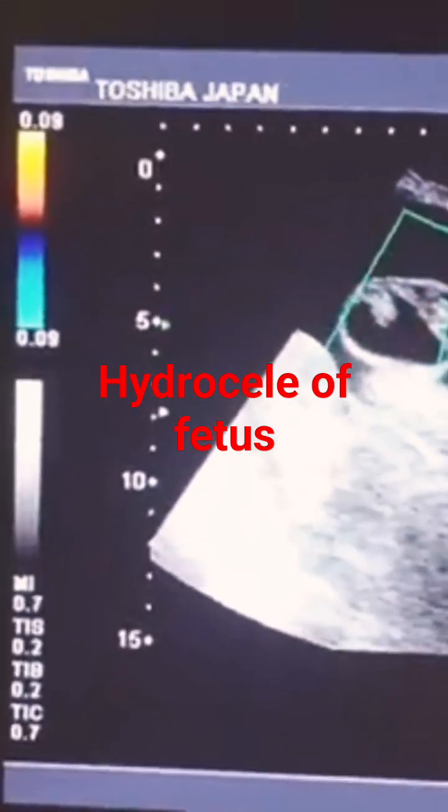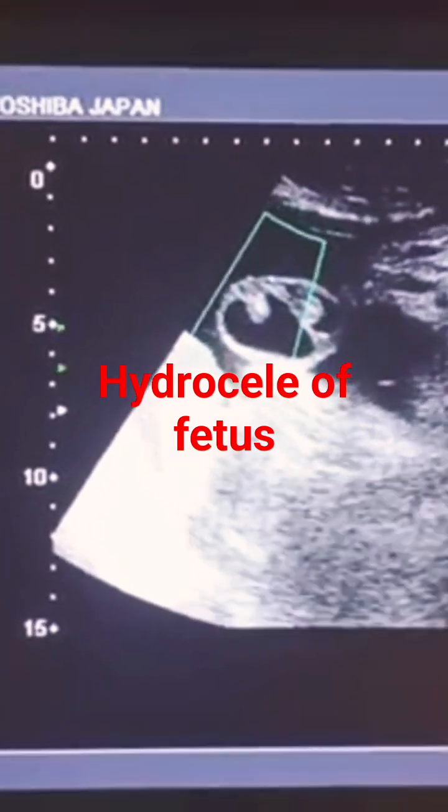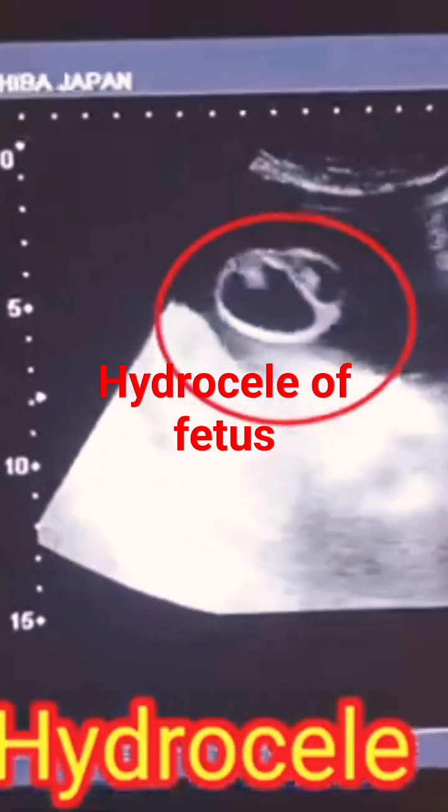You can put the color Doppler to rule out the cord or the testicle. Power Doppler study differentiates between the cord and the testicles.